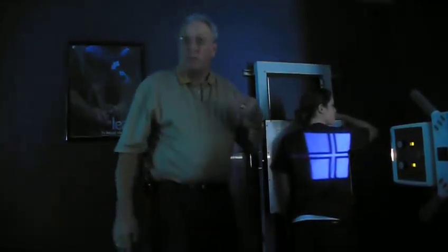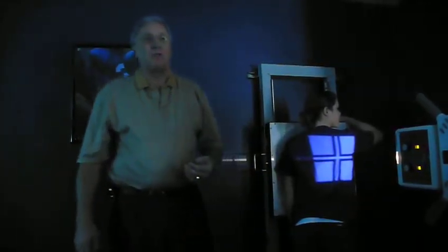What do I do when I do my oblique? When you do anterior ribs? So, 16 to 20 degrees? 45. You can have them rest their arm up there, wherever it's comfortable, get it out of the way. There's my oblique view.